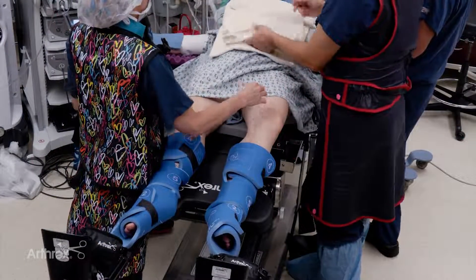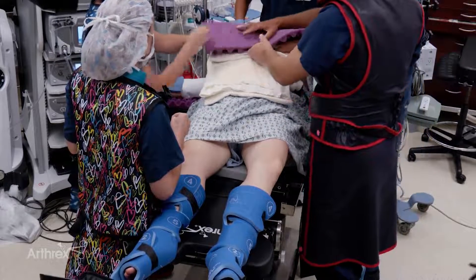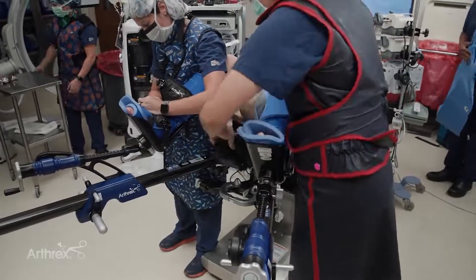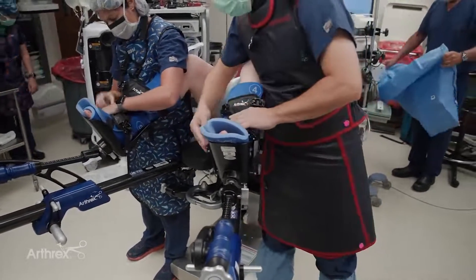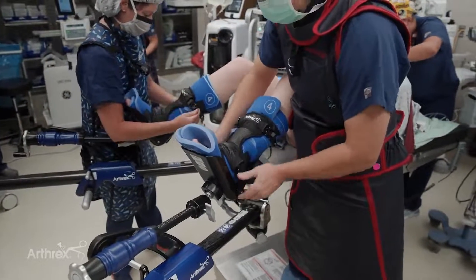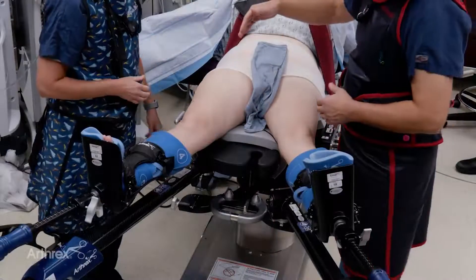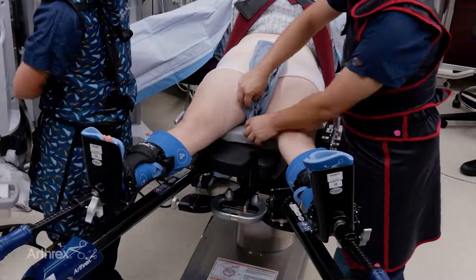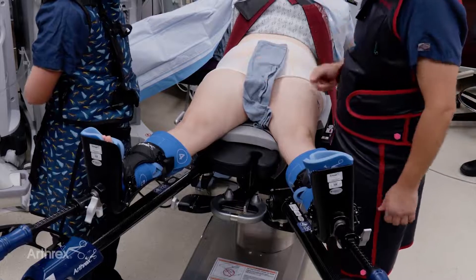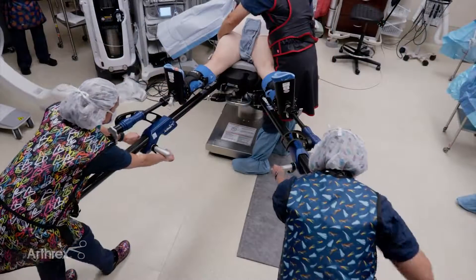We use three blankets for a secure fit and padding of the extremity. Then we move to the feet, place the feet into the traction boots in flexion, which gives a better fit of the heel down into the device. Make sure we're centered and put it down until it gives resistance, but it doesn't have to be overly tightened. Ideally, we'd like her positioned based on the pad with the black line. In this case, she seems just a touch proximal, so we're going to gently move her down.